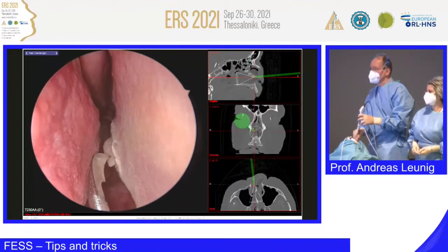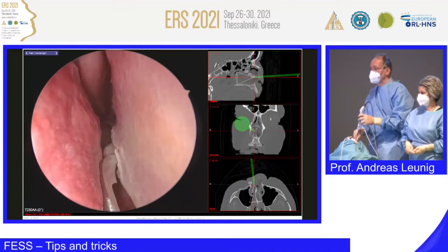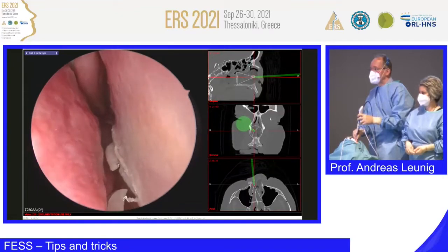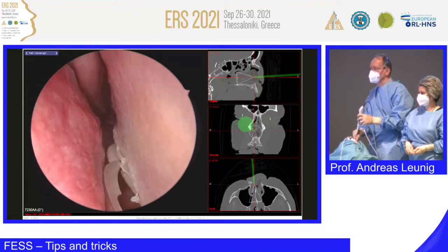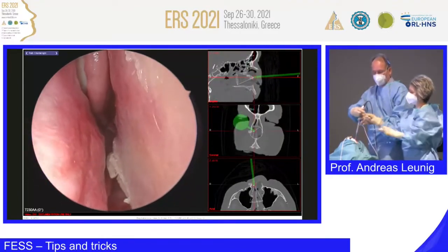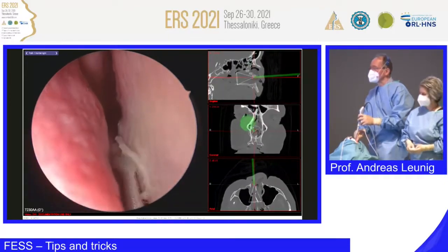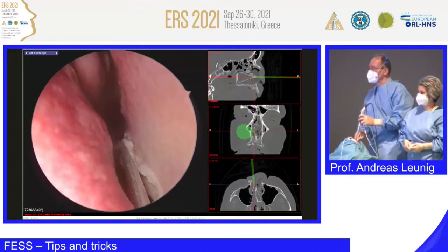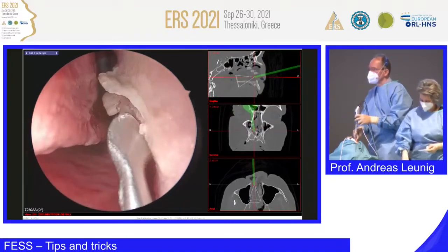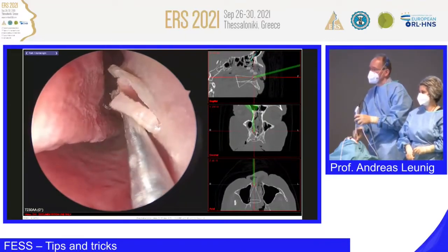So what you could do, I mean, this was my fault, but it's better to see me fighting than doing a 100% perfect thing where you think, oh, it looks easy, but it is not. Now, I expose a little bit this bony or cartilage part, please, Joseph. And what you can do, you can just elevate a little bit the mucosa of the septum. You do it superiorly, and you can do it as well. This here is cartilage. You can do it as well inferiorly. And now Blakesley or a smaller one.